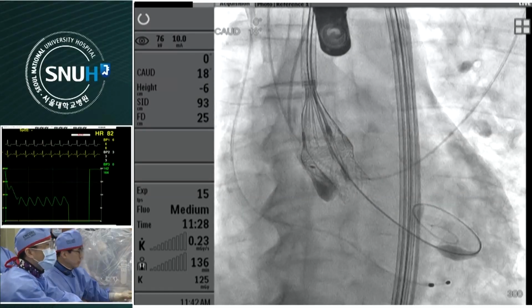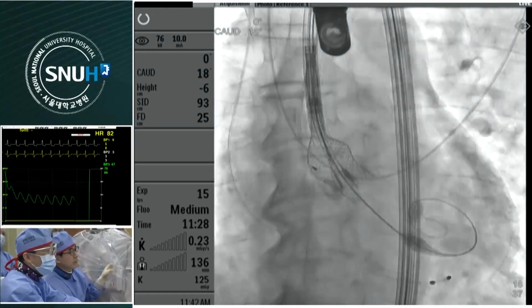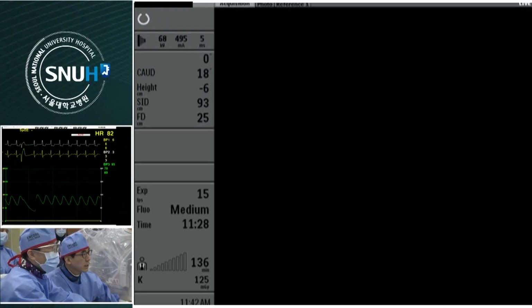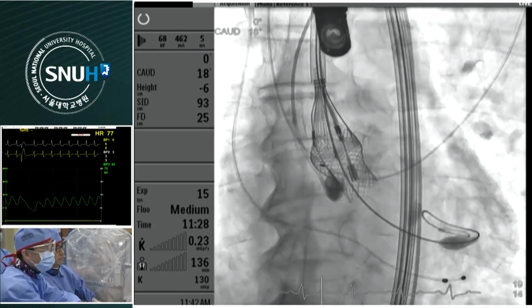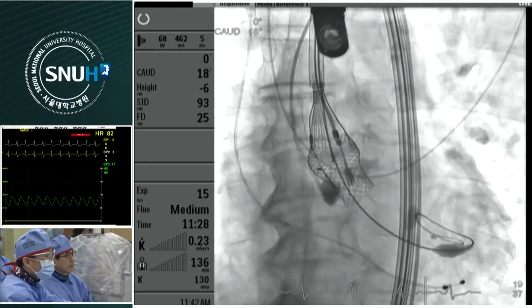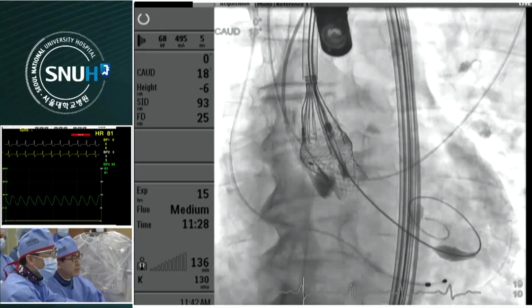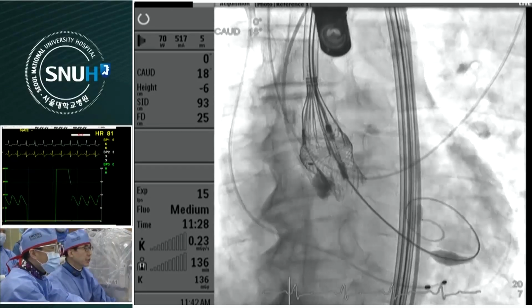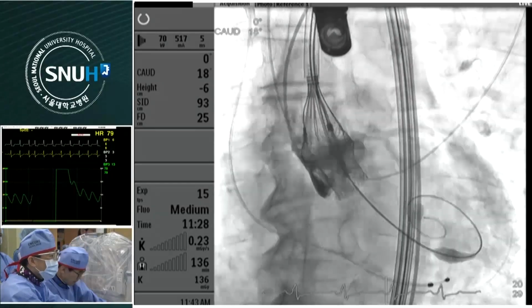How about coronary flow? Maintain. Looks good. Good. Okay. Let me show you the cine view. You have to continue to push. Are you sure? Ready? Okay. Once again, cine. It's good. Depth is okay. Thus, I proceed with the process continuously.